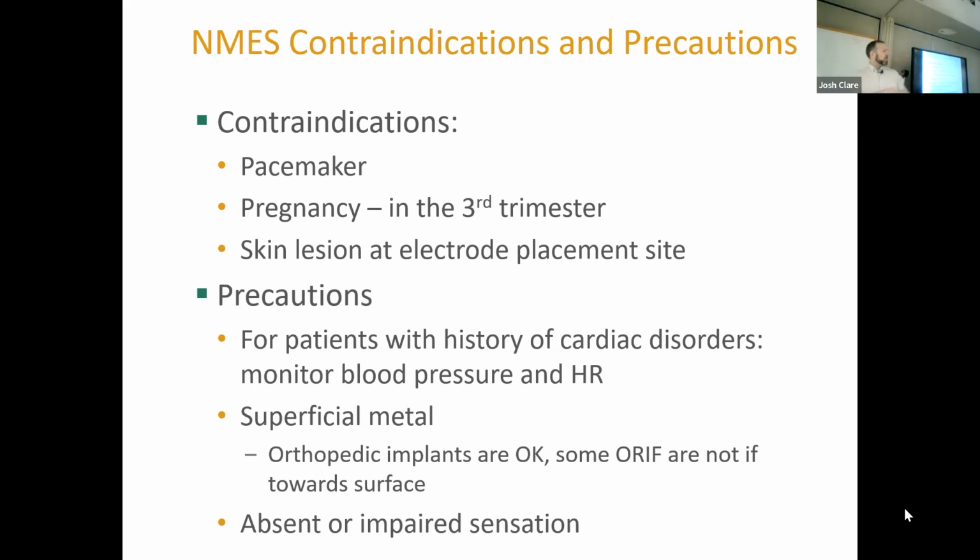So you had pins in your hand? No, that's right. You avoided surgery. So if we had pins in our hands, maybe a distal radius fracture, a history of pins in there, that's where I would start going, I don't think I'm going to do that. But knee replacements, hip replacements, no problem. And actually, we do it often after knee replacements, right? Is that when you see it, or mostly ACLs? ACL is the number one that I've seen use it for.